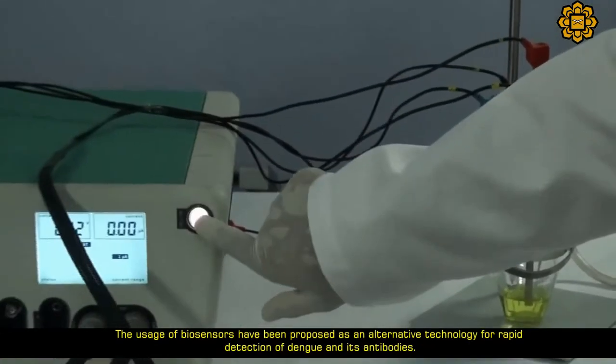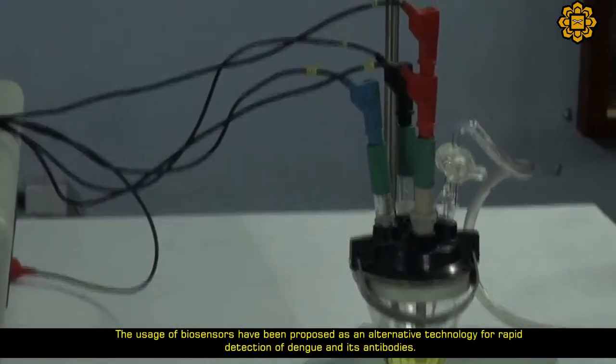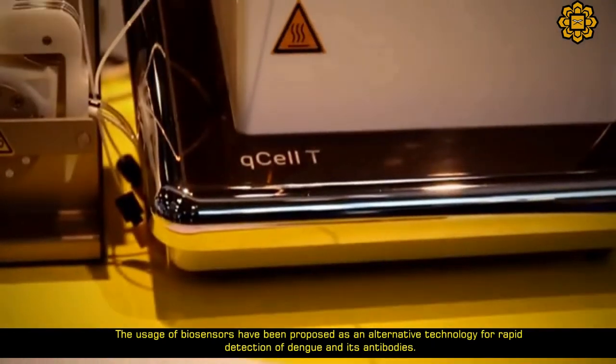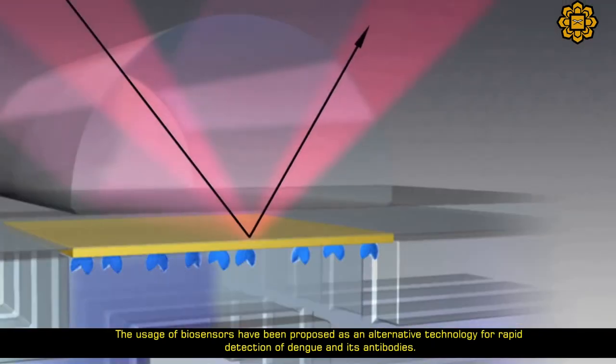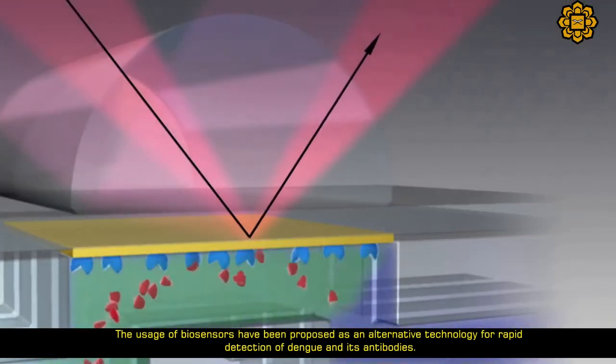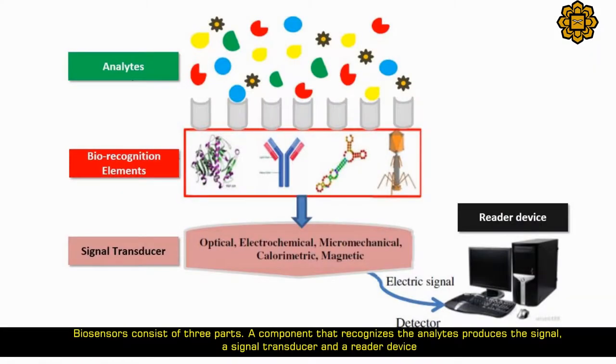The usage of biosensors has been proposed as an alternative technology for rapid detection of dengue and its antibodies. Biosensors consist of three parts: a component that recognizes the analyte and produces a signal, a signal transducer, and a reader device.